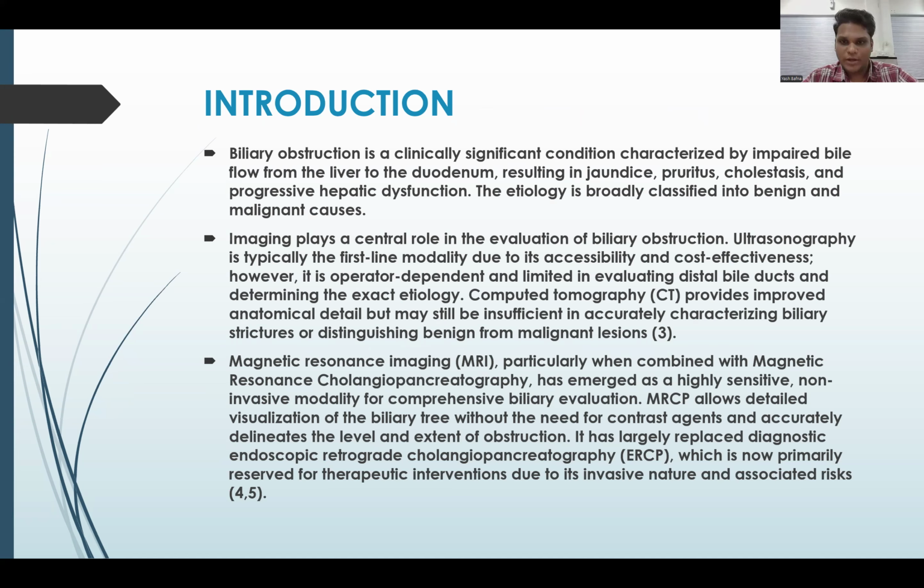Imaging plays a central role in evaluation of biliary obstruction. Ultrasonography is typically the first-line modality because of its accessibility and cost effectiveness, but is operator dependent and has limited use. CT provides improved anatomical detail, but may still be insufficient in accurately characterizing the biliary obstruction or distinguishing the benign from the malignant causes. MRI, when combined with MRCP, has emerged as a highly sensitive, non-invasive modality for comprehensive biliary evaluation.